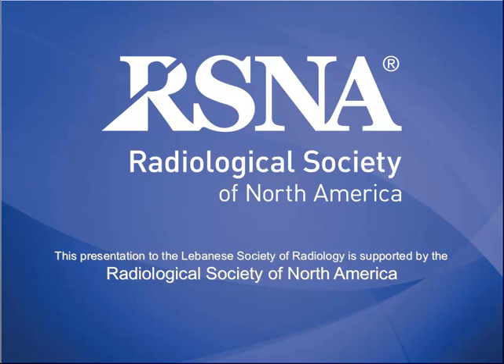Yeah, thank you. I have a question from the audience here. I was just wondering, thank you for the nice presentation. Most of the papers you showed us were dated 2011, the latest 2013. What about the use of the new dual CT, the spectral imaging for reducing the dose, especially for pediatric patients who are using these with very low dose? What do you think about these? We have been using these for 3 or 4 years.